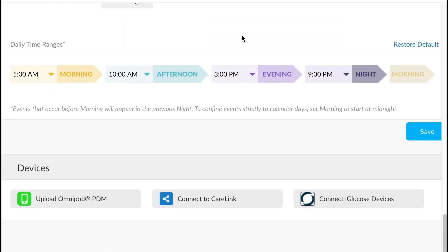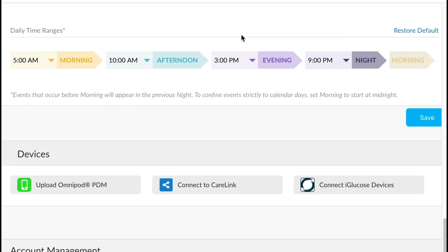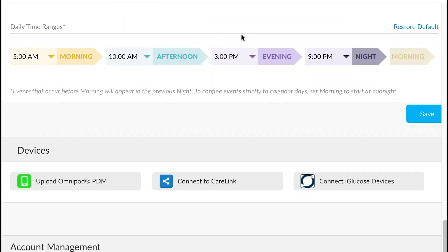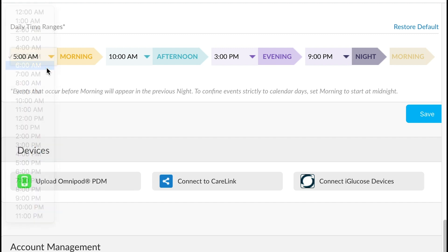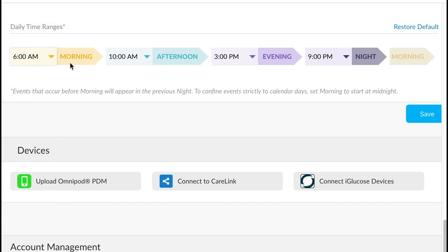Moving down to daily time ranges gives us the option to adjust when a patient's morning, afternoon, evening, and night are represented. So if we wanted to change the morning time period, we would just click on this arrow, and we could change that accordingly. As always, make sure you push the save button before you finish.